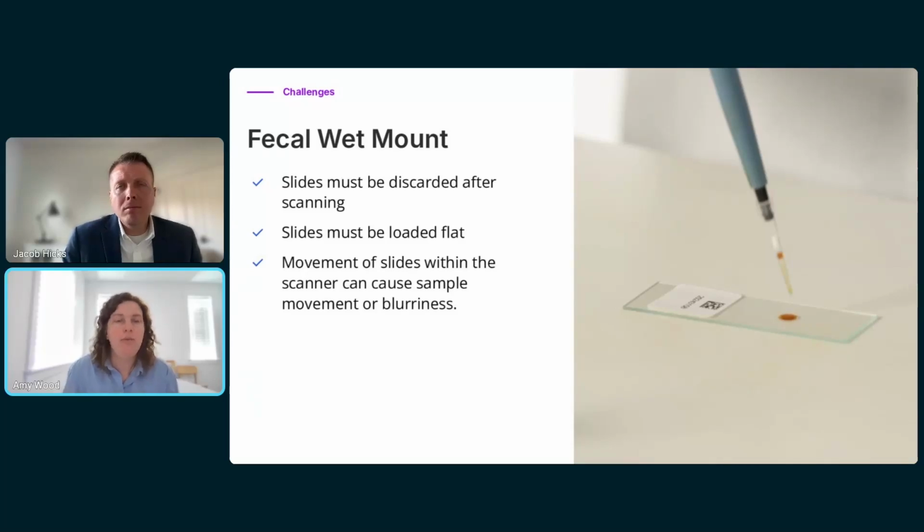And if we need another look, we have to prepare another sample. So being able to accommodate that difference in workflow was a challenge that we had to work through. These slides must be loaded flat. As I said, we'd like to disrupt the sample as little as possible. So keeping them relatively flat as they're being loaded and unloaded is really important.